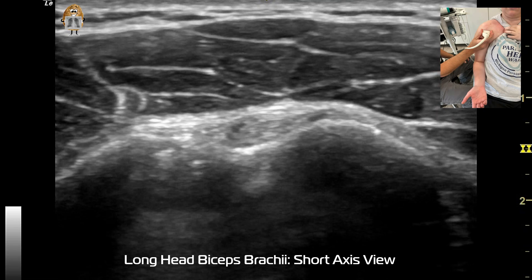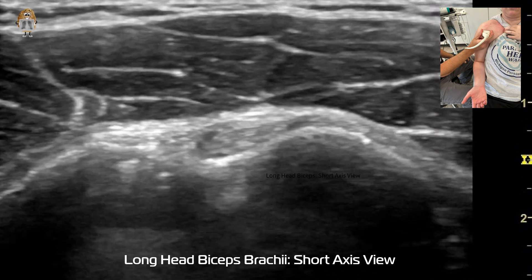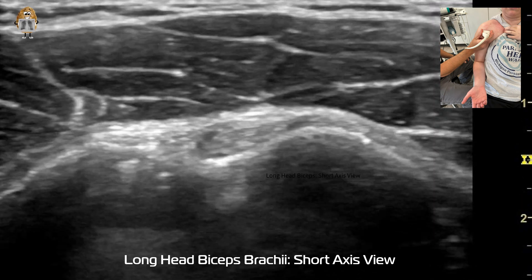Let's start with a short axis view. You can see this live action ultrasound imaging, and now we have some still shots we can analyze. The patient is positioned with the forearm supinated and the shoulder in neutral rotation.